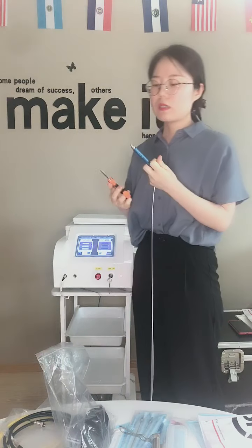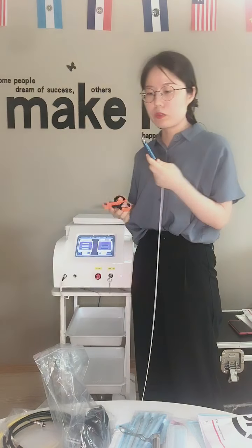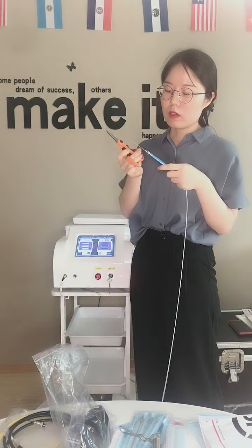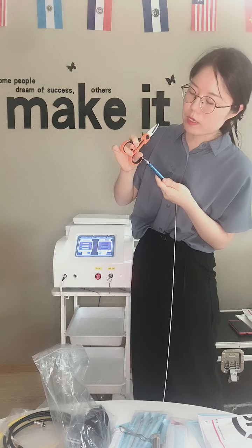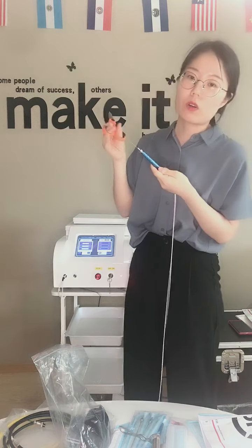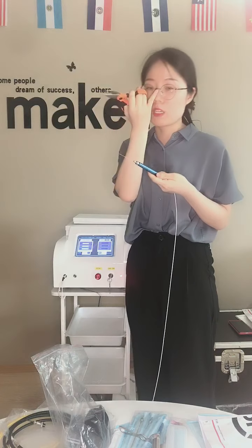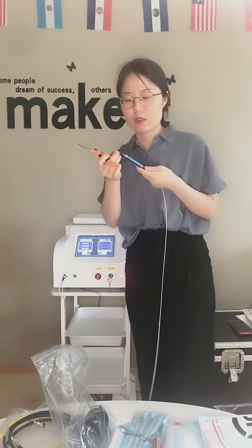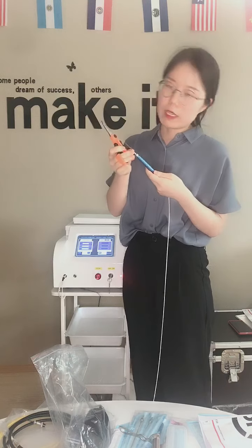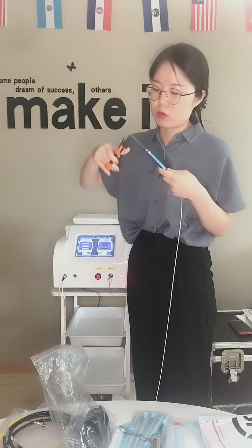For the optical fiber, this is a consumable. So each time after you use the fiber, you need to cut this part. For example, this 3 centimeter gets into the body and the effect is blood or mist or something here. So you need to cut it after the treatment to avoid infection. Because the fiber is not easy to disinfect, the best way we suggest is to cut it.